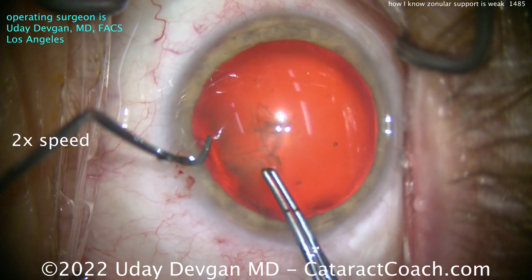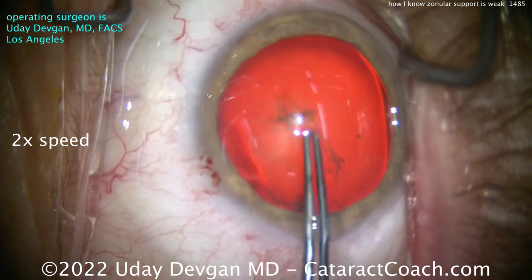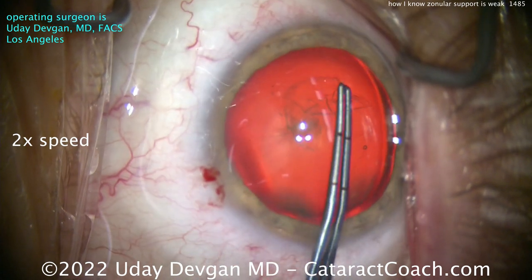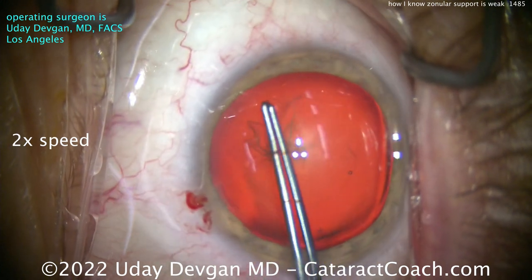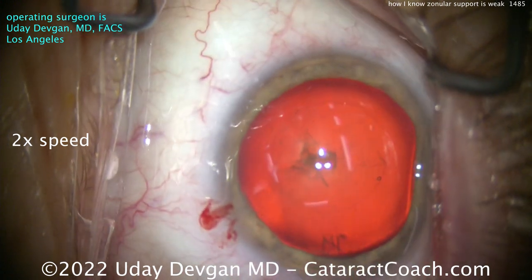Finally I'm able to puncture into the lens. Let's see if we can get the rhexis done. The rhexis goes okay — I'll make a five millimeter rhexis here. Measuring out again with the forceps, get the rhexis done. But this is going to be some serious zonular laxity, especially in the area to the right of the phaco incision — the bottom right corner of your screen.